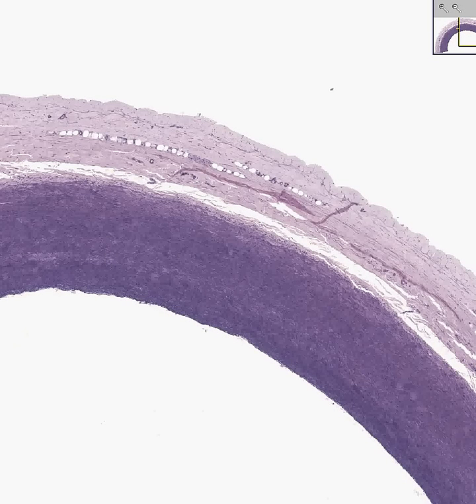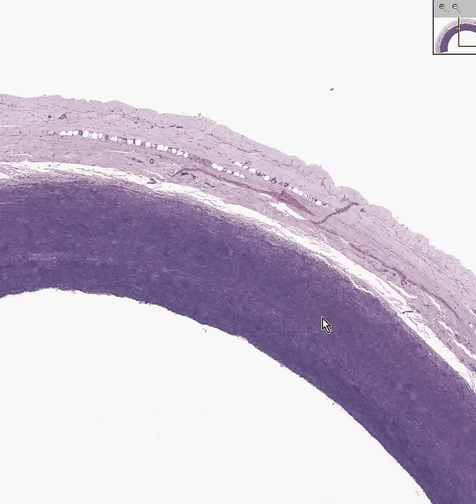Here again you could see, like we saw in the previous case, an aorta. And this is not an H&E stain, that's why you don't see much pink in the stain. But you see a lot of dark blackish material comprising the majority of the media, or the middle layer of the aorta. And the reason why it's so dark is that this stain is fairly specific for elastic fibers.